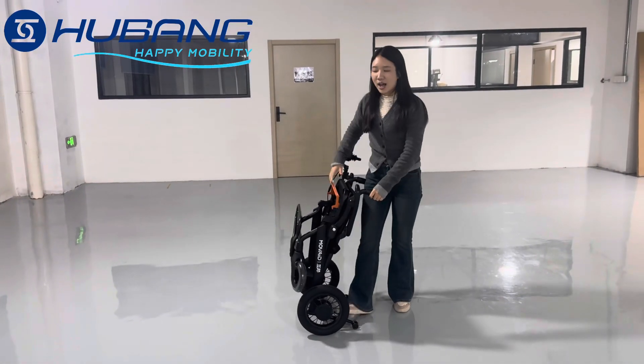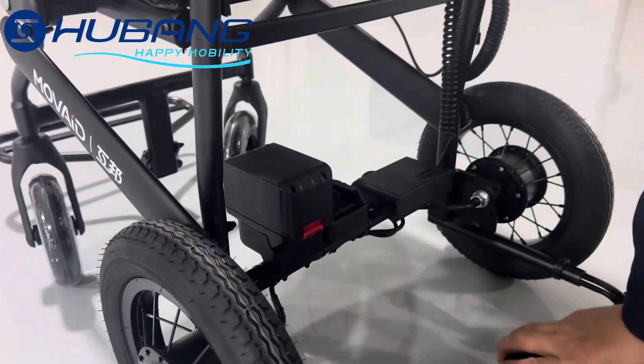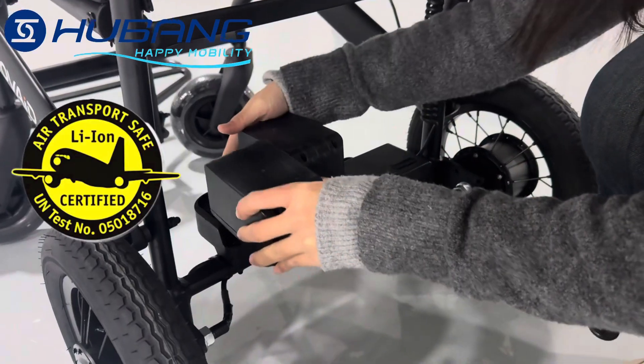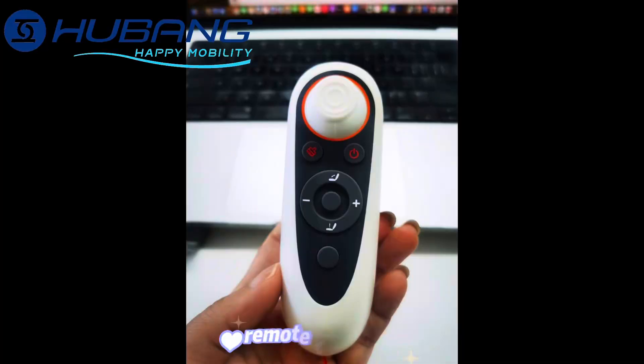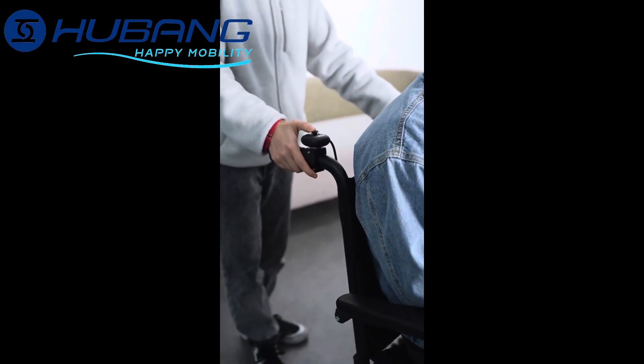It is very affordable and a good tool for travel. Our battery is completely removable and even airplane approved with certifications, which makes travel so much easier. This wheelchair can be matched with a remote control or wheel control, perfect for when you are accompanied by someone.